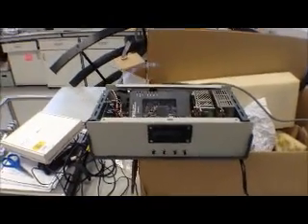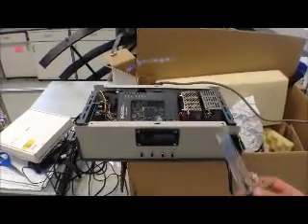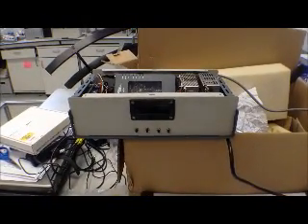This is the box outside of the case, and as you can see, everything wires up and the device is connected to the HD plug. It all comes in. The case will normally have a roof on it, and everything can then be stored back into the briefcase for easy travel.